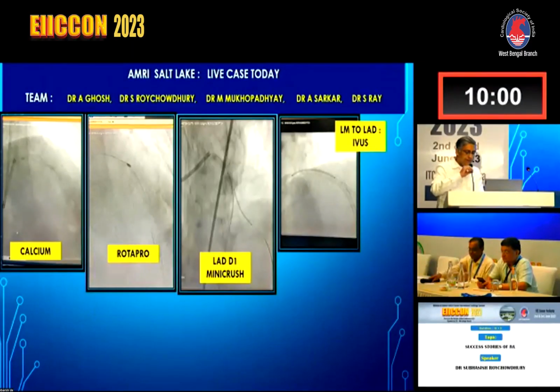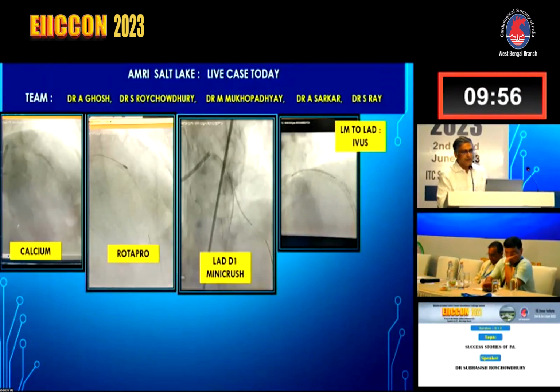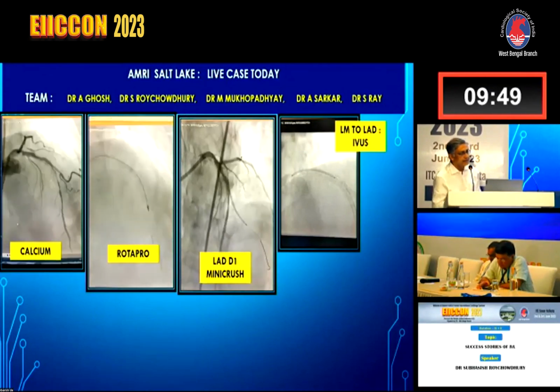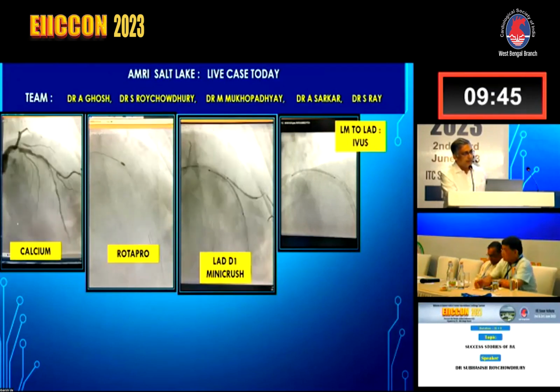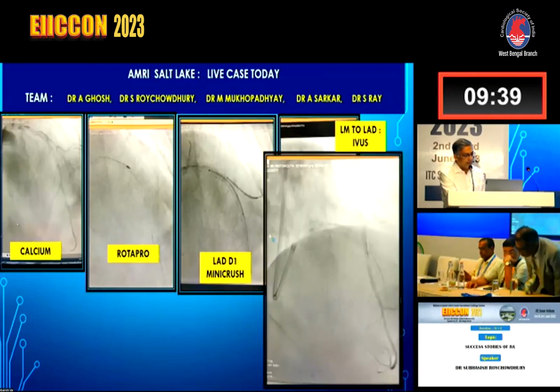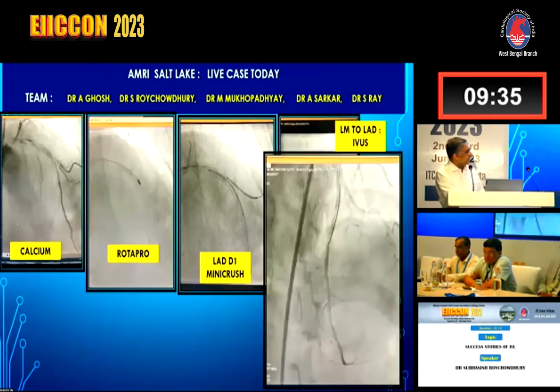Before coming to the success story of IVL, let me share the success story that we had today from the live case at AMRI Salt Lake. Due to paucity of time, we could not show you the last result for the heavily calcified lesion, in which we used a 1.5 RotaPro and did a mini crush of LAD-D1 and a left main to LAD IVUS. And this was the final result that we achieved. So we couldn't show this during the live case transmission.